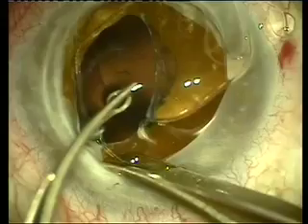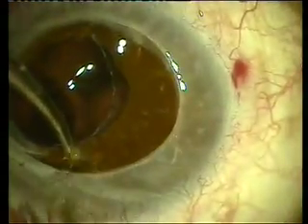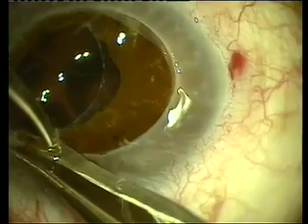This haptic is removed freely, the other one is embedded into the angle — we're amputating that haptic and fishing into the angle to remove the part of that haptic that has remained.